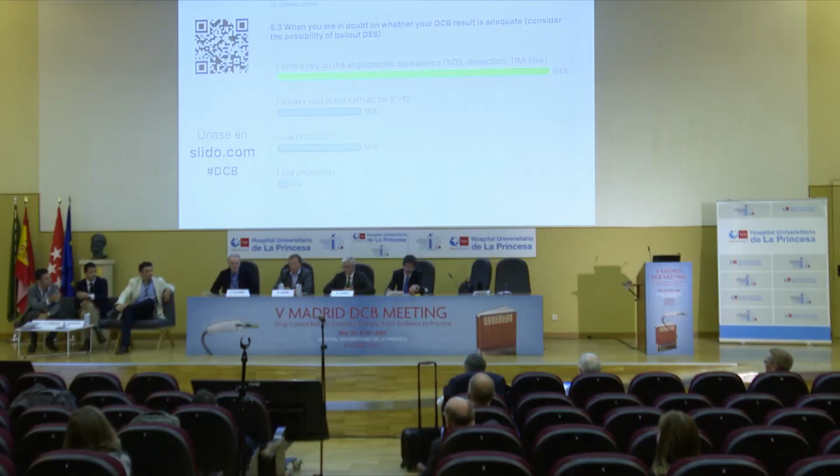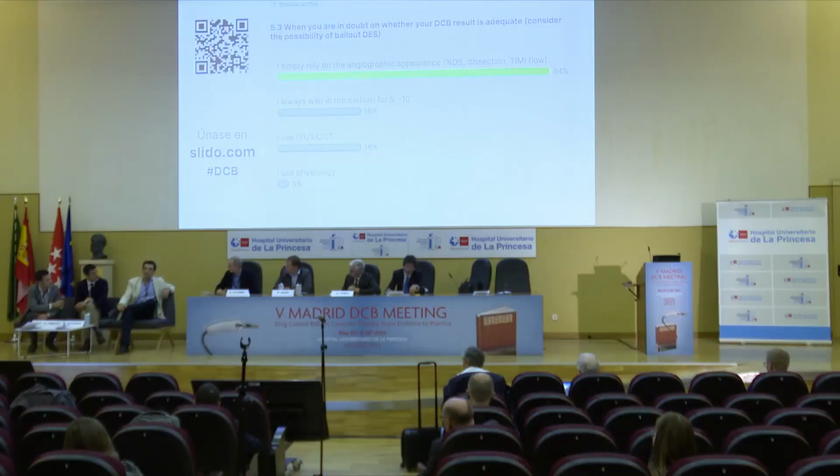And if you are still in doubt, use intracoronary imaging. I think it's amazing that physiology got 0%. But maybe in the future, with the availability of QFR, people will use it more, because you don't need a dedicated wire, you can get it immediately. I think with physiology, you are in that because you have a stenosis, no? But if you are thinking about a dissection or something like that and you are not sure, I'm not sure physiology is the best.